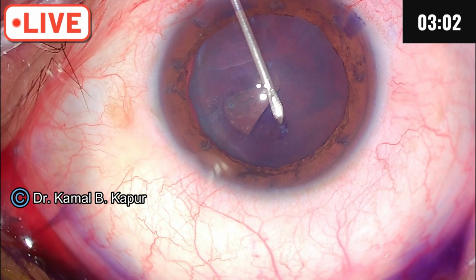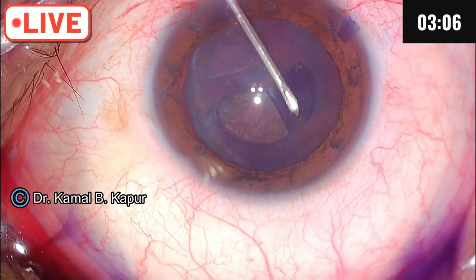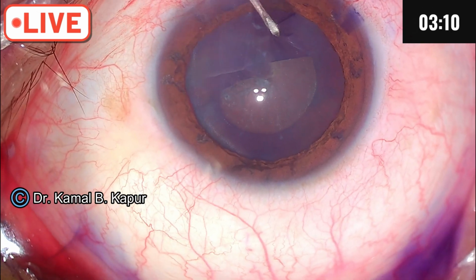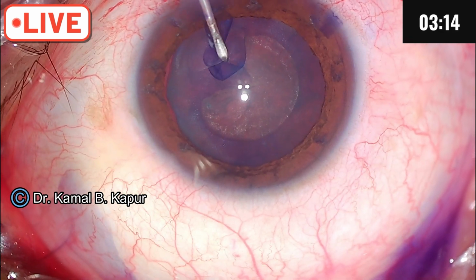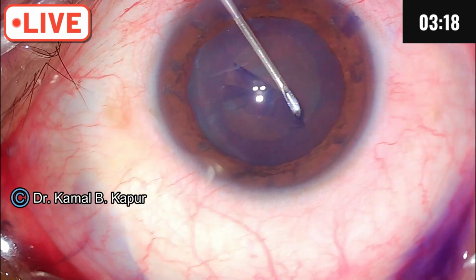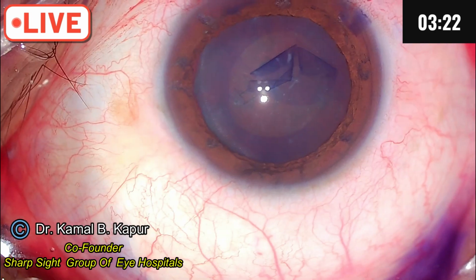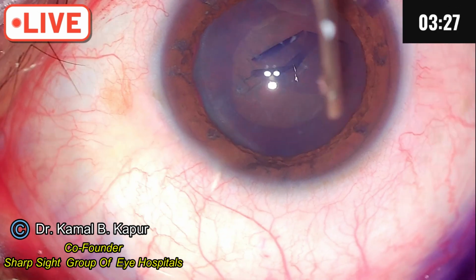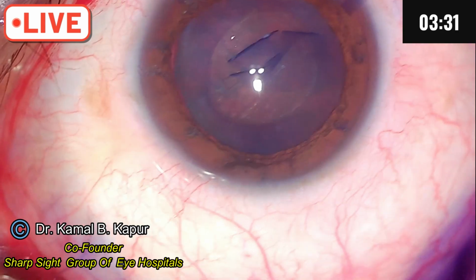You will notice the rhexis doesn't have to be very large, otherwise the CTR will tend to come out of that zone. Now we want a slightly longer flange here. Visco please. So this whole area right from here till here is subluxation.